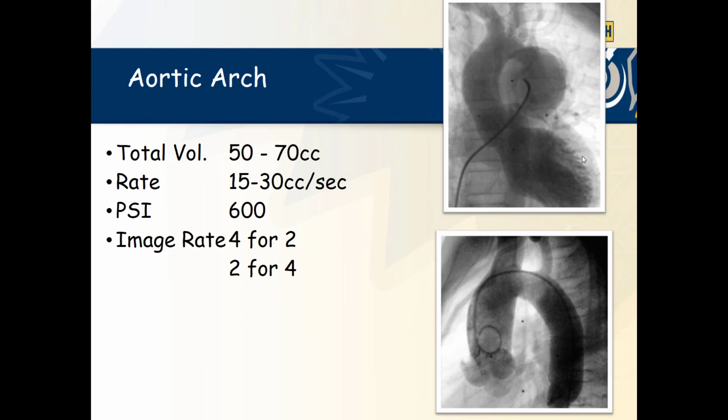If we take a look here, you can see the left ventricle. Here you can see the aortic valve, and you can see the aortic arch comes over, and then we have a stenotic region right here, real close to the left subclavian takeoff. And then after that, we have this big aneurysm here. This aneurysm is a post-stenotic aneurysm, and it's because of the turbulence produced by going through that narrowing. And so you get a post-stenotic aneurysm. So this is coarctation.